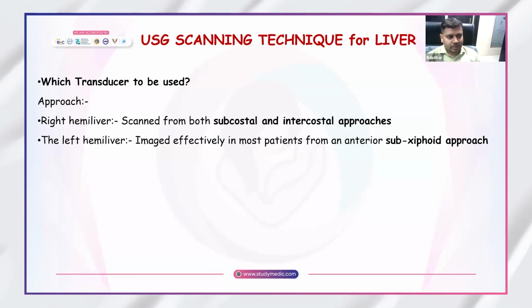The common indication for the examination of the liver is definitely subcostal pain, or it can be for any abdominal examination, so liver examination is part of abdominal examination. We do it commonly for other reasons as well, for infections, for localization of metastatic malignancy. N number of indications are there.